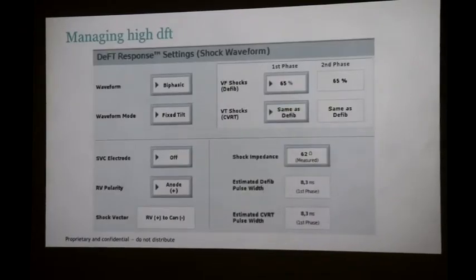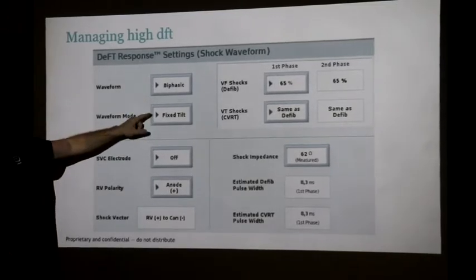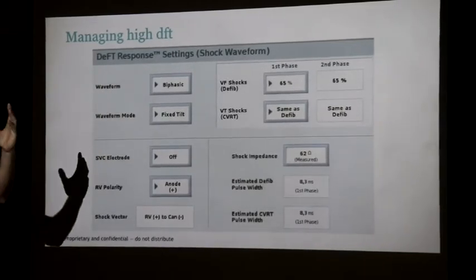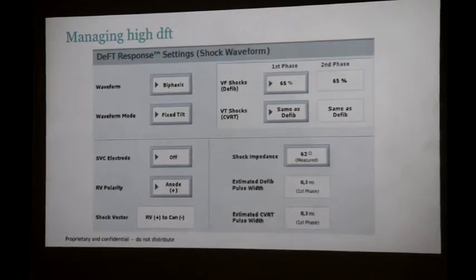Okay, so here are all the options. Our waveform is biphasic. It's a fixed tilt, right? Fixed tilt means the device will stretch the waveform to get all the energy out. So it stretches the waveform. So high impedance, longer waveform. You'll see what happens in a minute.